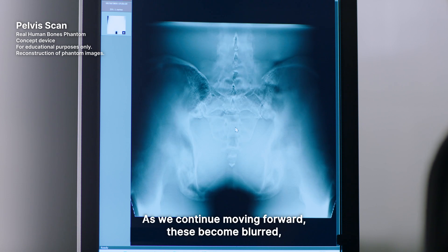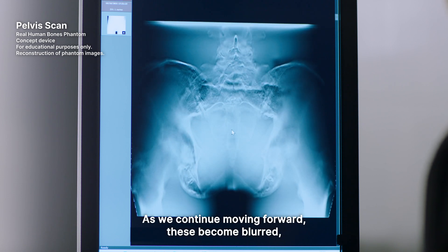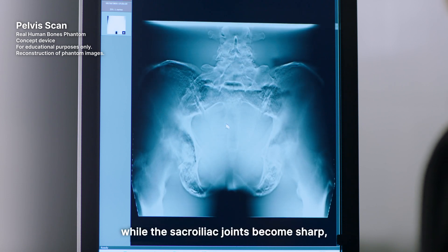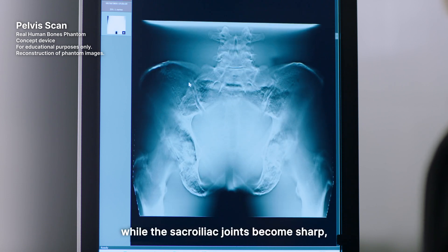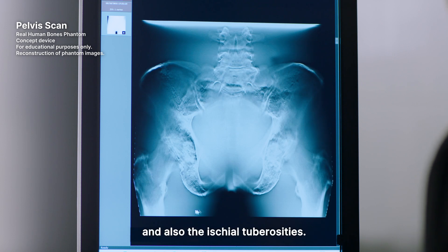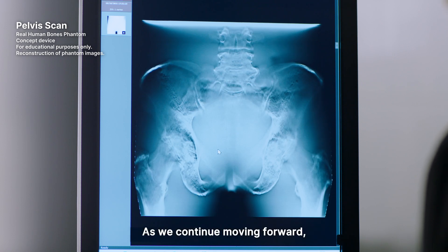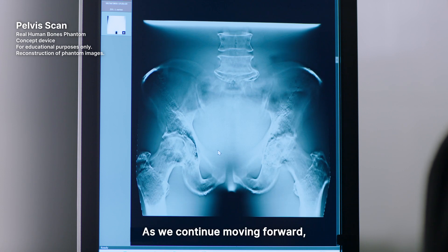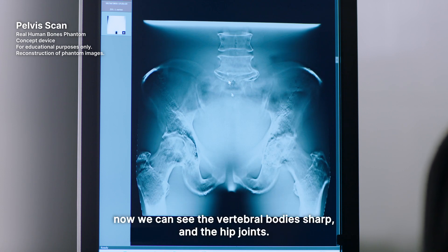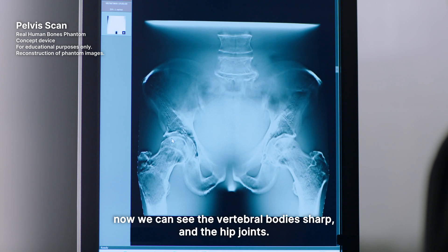As we continue moving forward, these become blurred while the sacroiliac joints become sharp, and also the ischial tuberosities. Continuing forward, we can now see the vertebral bodies sharp and the hip joints.